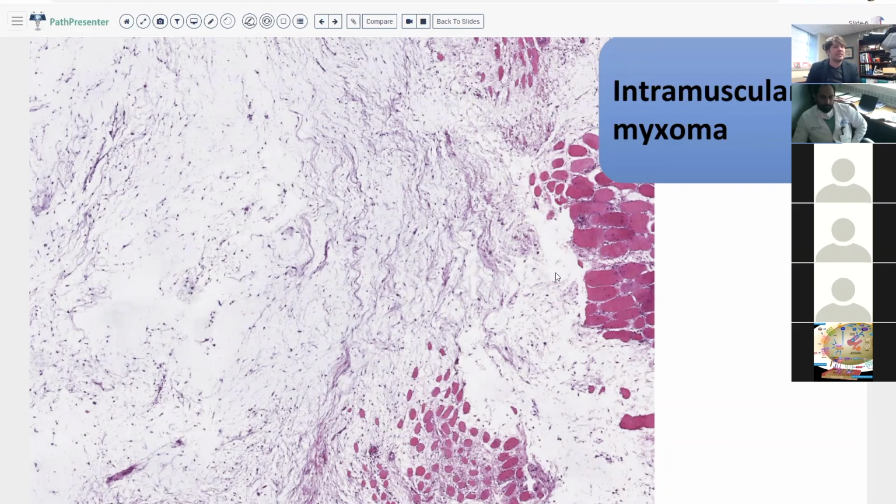That is not invasive infiltrative growth, okay? The same is true of intramuscular lipomas. They do the exact same thing. They spread apart and splay apart the skeletal muscle fibers. And that could look scary at first if you're not familiar with it and make you think, oh, this is an invasive infiltrative thing. Remember that in soft tissue pathology, infiltrative and invasive, like we use when we're talking about, say, carcinomas or epithelial tumors, the same rules do not always apply.